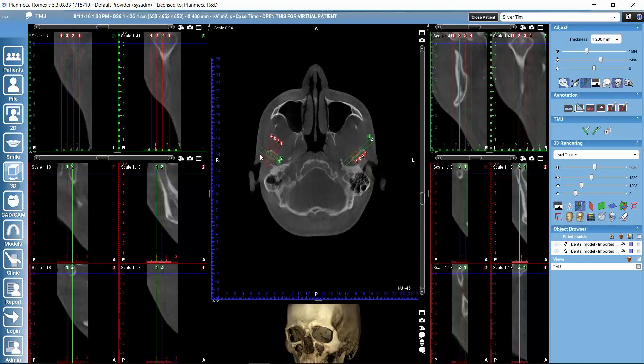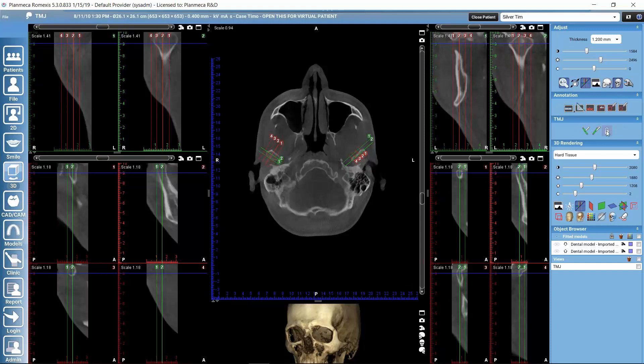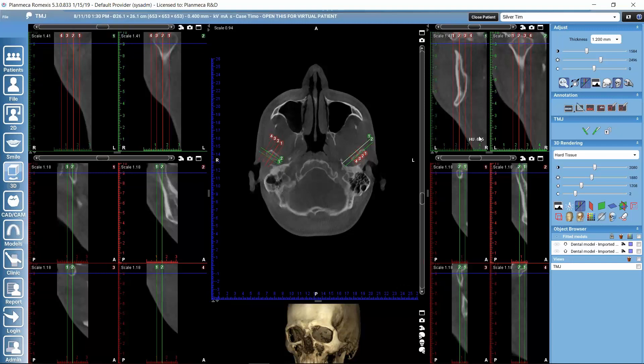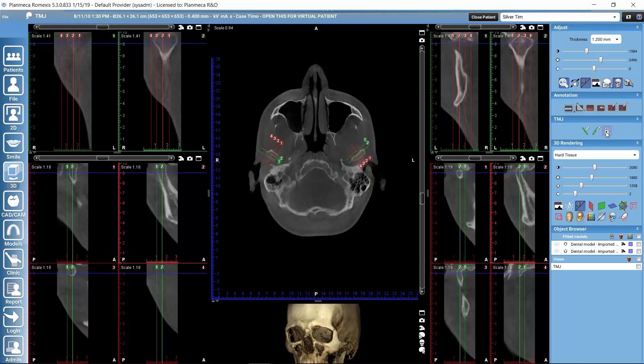We can check later how to adjust that. And we could use this other tool to define the same thing for the other side. What this lock icon does here, this is if we want to synchronize the length on both sides. If we activate the lock, we can have the same length on both sides at all times. But if we have deactivated the lock so it's kind of open, then we can define a different length on each side. If I click here to synchronize, then that restricted the length here on the other side.